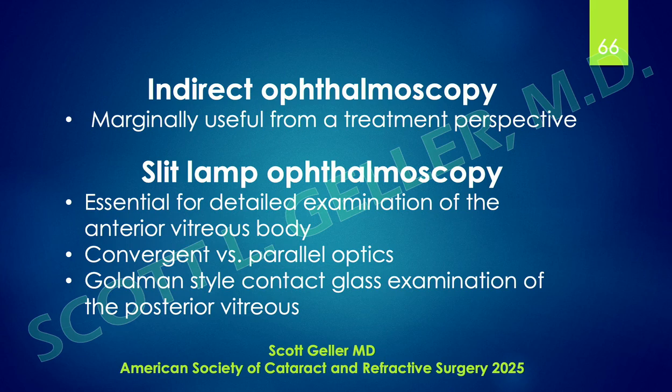I usually use a Goldman contact glass for examination of the mid and posterior vitreous. The Goldman lens allows me to see not only what the vitreous looks like, but how things move. Not every patient has a posterior vitreous detachment. Many patients in their 40s can get a fibrillar degeneration in the mid-vitreous. If it's bilateral, it's extremely disturbing. If it's unilateral, they can live with it, but these are fairly easy to treat from a laser perspective.